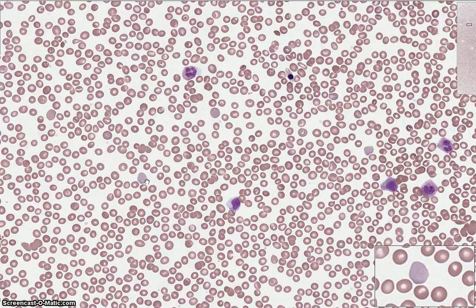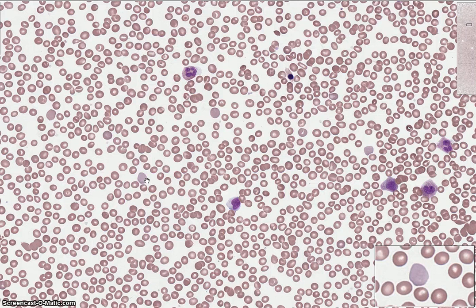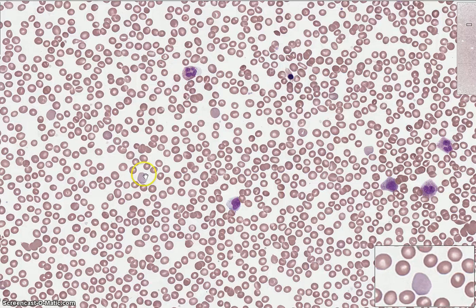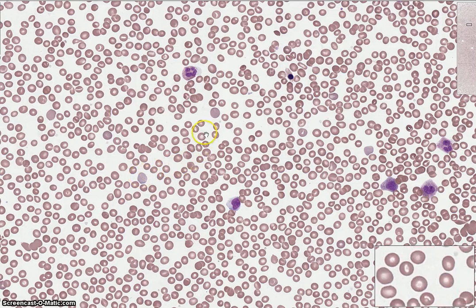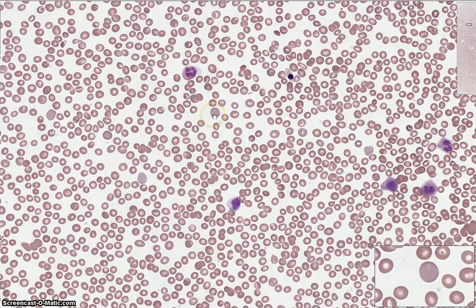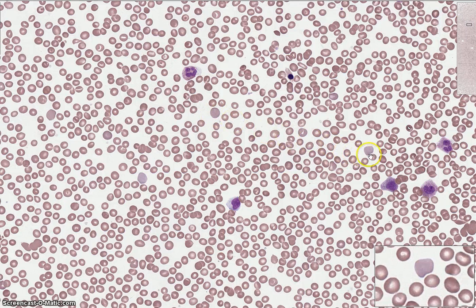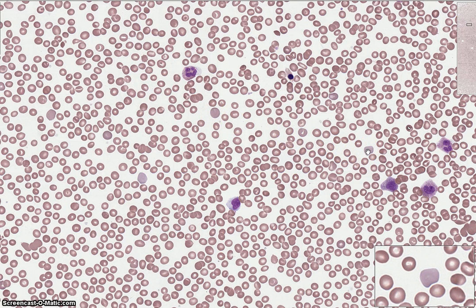After the orthochromic normoblast gets rid of its nucleus, the next stage of development is the reticulocyte stage. These are flat-looking cells with no area of central pallor and slightly purple cytoplasm — there's one here, one over here, and another one down here. The size of these reticulocytes is just a tad larger than the mature red blood cells. This is the last stage of erythrocyte maturation prior to the fully mature and functional red cell.